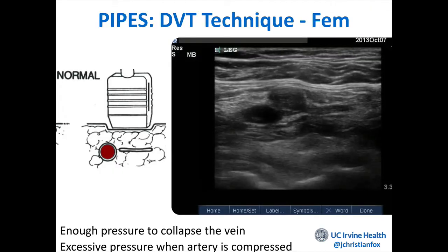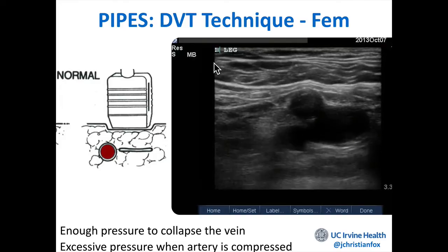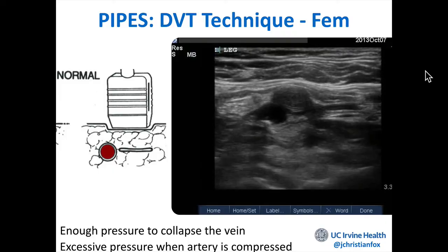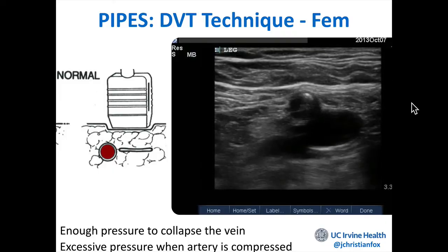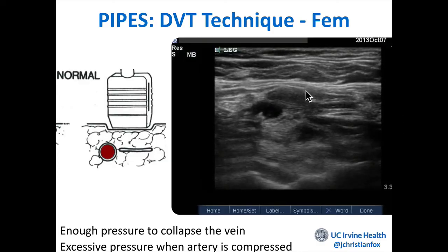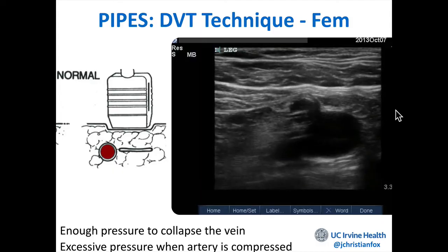And this is what it looks like here. You just compress. Here's the right leg. Indicators to the patient's right. And the way I remember that is that venous rhymes with penis, or you could say venous vagina, and that's what's closer to the organ that's right here, not on the screen. So lateral is going to be these two arterial structures, and the vein is medial, venous penis. That's how I remember that.